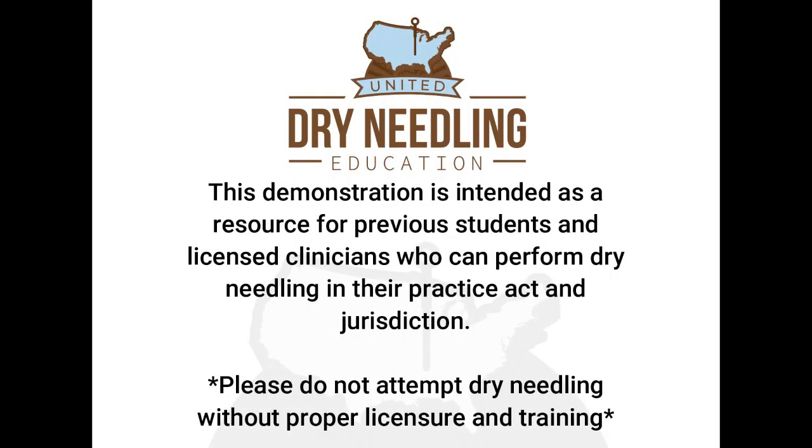This is some complicated stuff, so this demonstration is intended as a resource for previous students and licensed clinicians who can perform dry needling in their practice and jurisdiction. So don't do this if you're not supposed to.